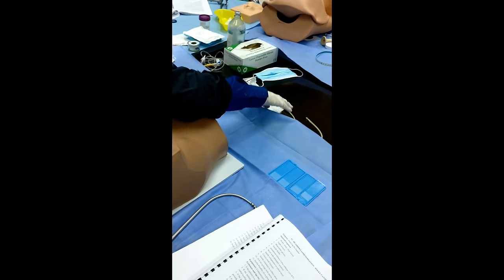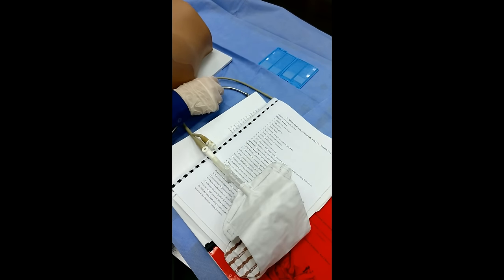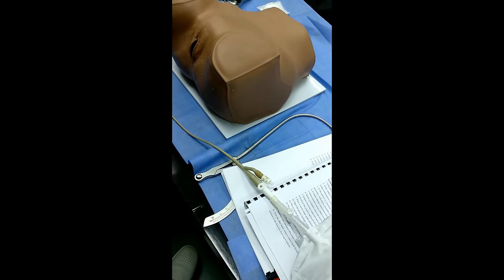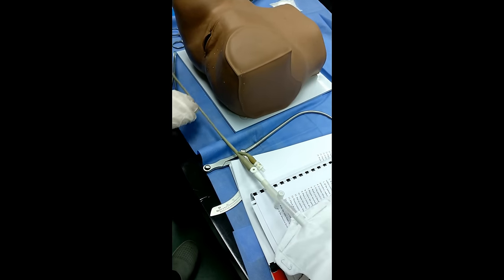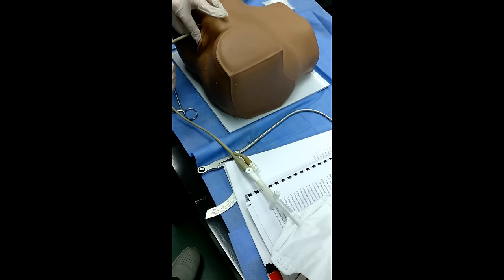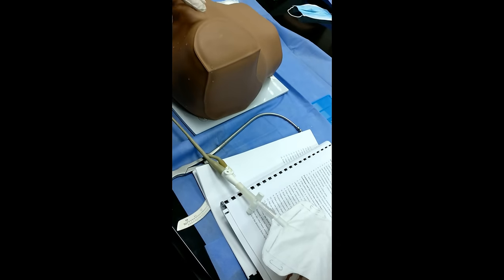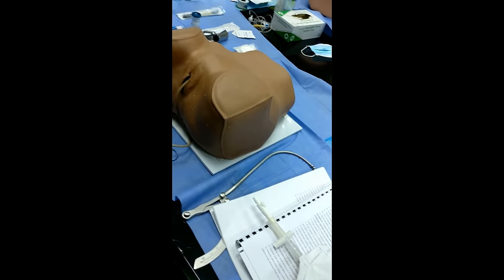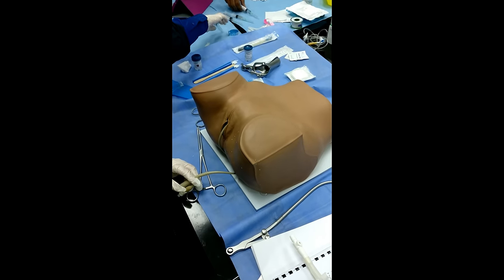Foley catheter. According to the checklist, you put antiseptic solutions on the urethra, and with an instrument or sterile gloves, you introduce the catheter in the urethra. Before introducing, you should check that the catheter is not ruptured and is functional. Introduce it into the urethra, into the bladder, until the urine spills out. Just the syringe.